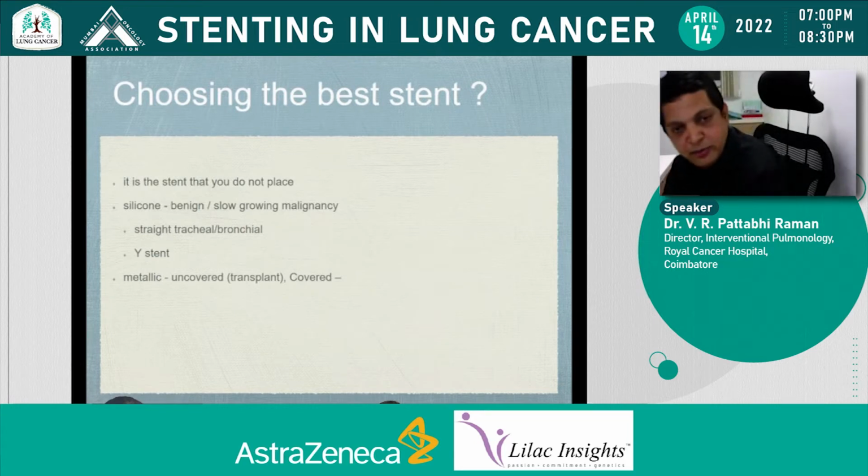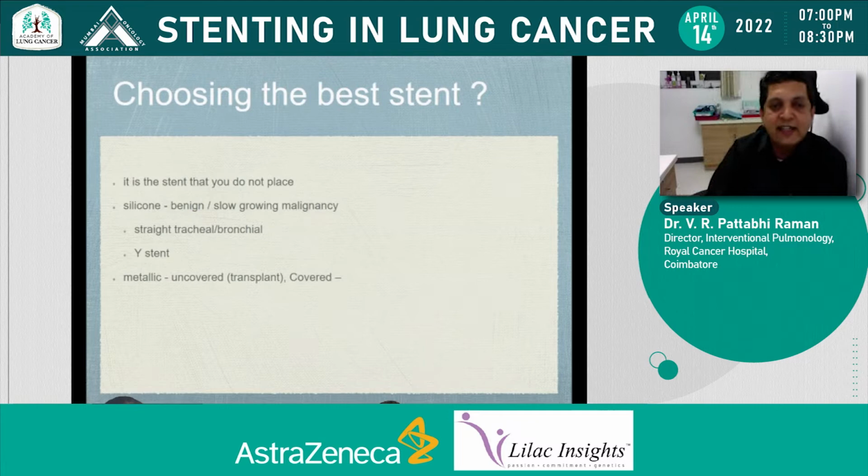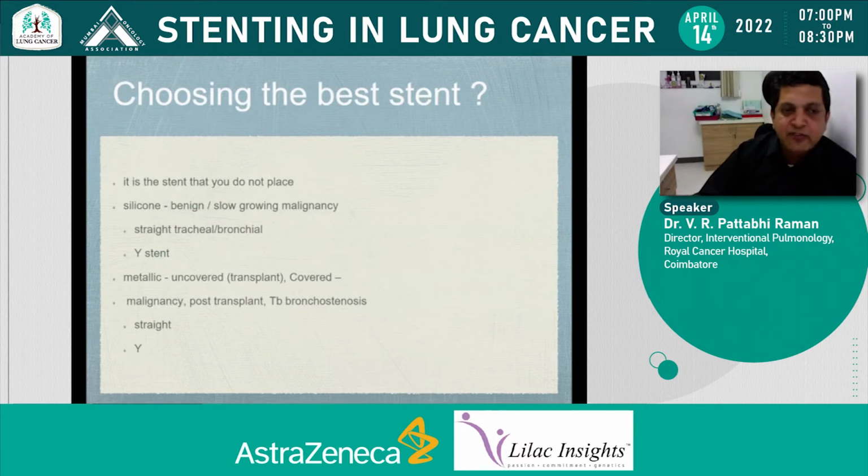And also, the reason why you put in a metal stent is that you think the longevity of the patient is going to be only about 6 months. Because the stents are designed, and this nitinol gets tired after that, and you can have complications. So this is purely for a stipulated period of time, whereas with a slower growing malignancy, the stent can outlive the purpose. So you might have problems because of complications of the stent.